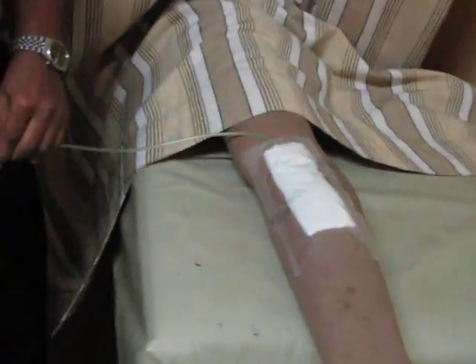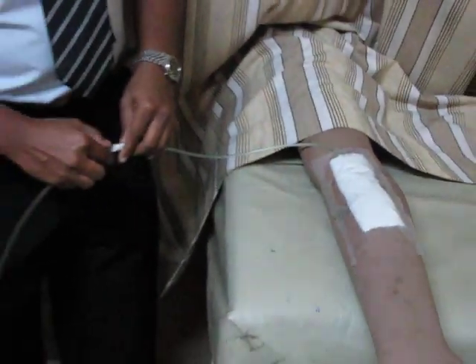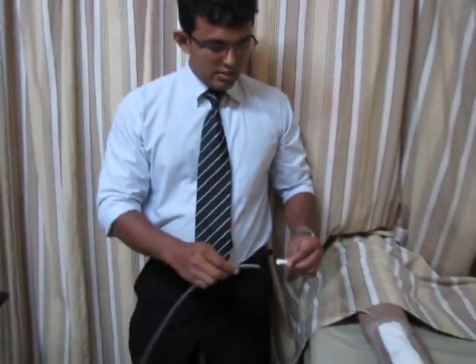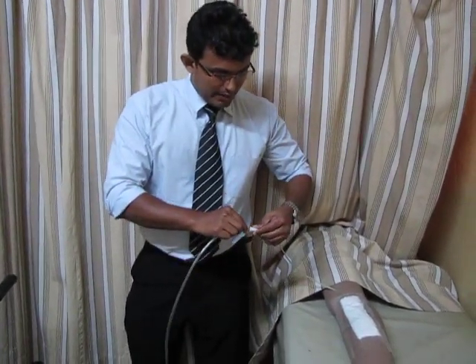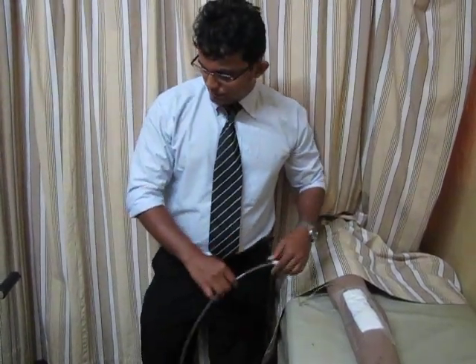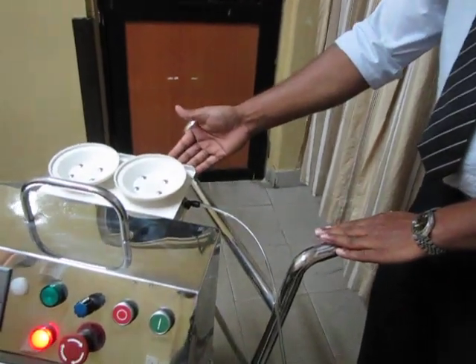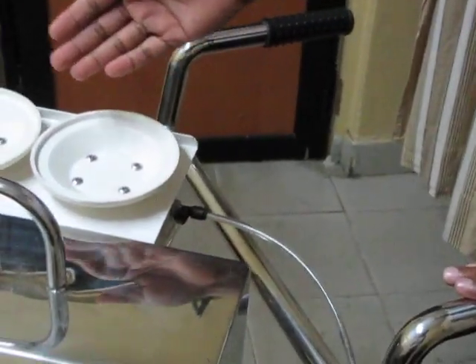Once we have achieved a good wound dressing after preparing the wound bed and having a good seal over the wound, we shall connect this tube from the machine to the drainage tube from the wound. The aspirate will drain into these drainage canisters, and the air will ultimately exit through a microfilter attached to the pump.